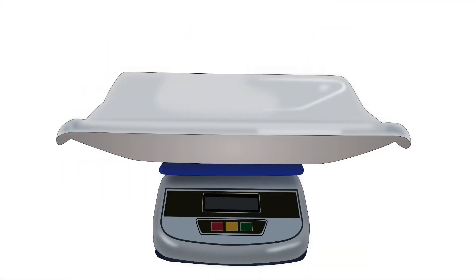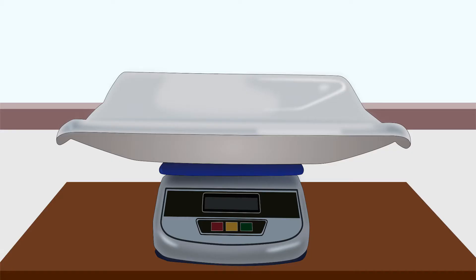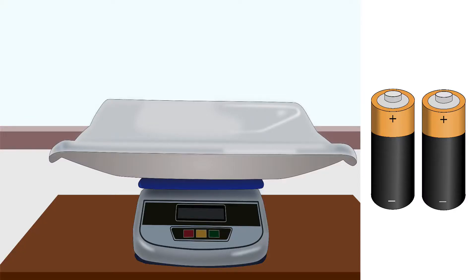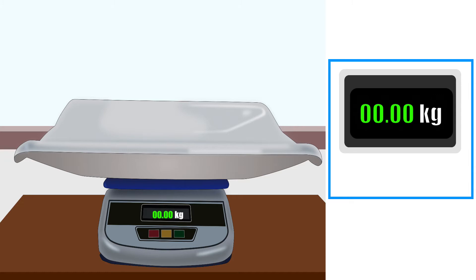Next, let us learn how to measure weight using a baby digital scale. Clean the tray and put the weighing scale on a flat, stable surface like a table or a platform. Connect the power plug. If the scale runs on batteries, put the batteries in it. Switch it on. The digital display will show some number. Adjust the digital display to zero by manually adjusting the knob. Some weighing scales have automatic zero display.